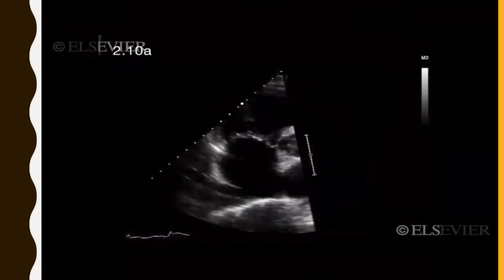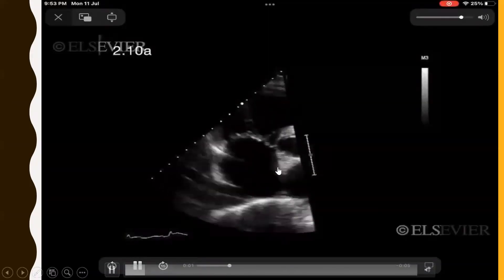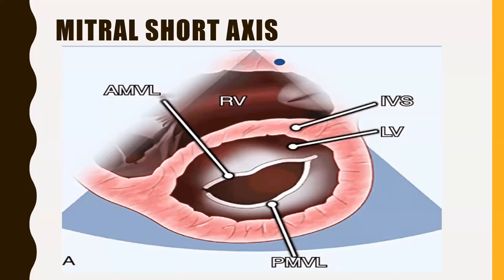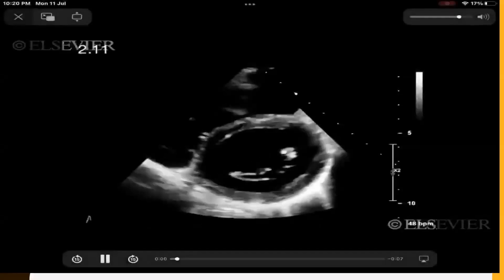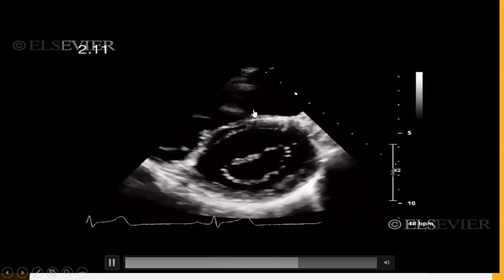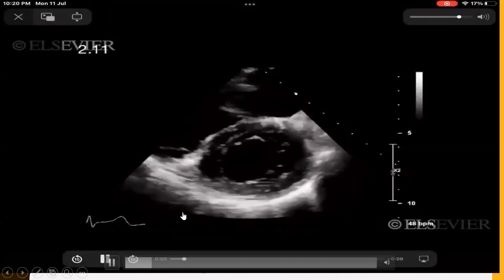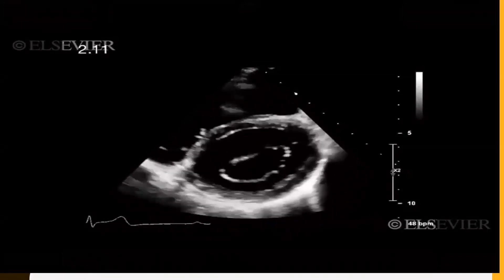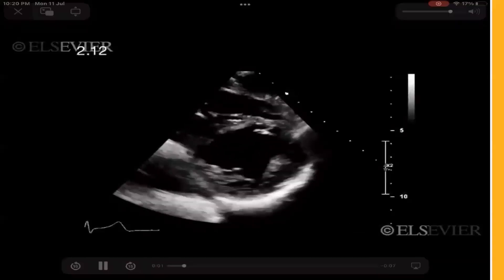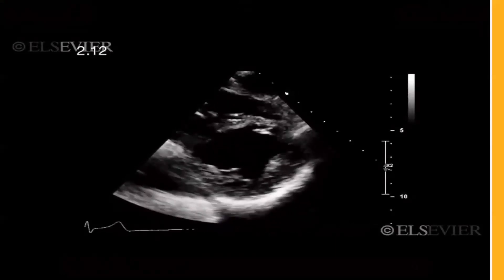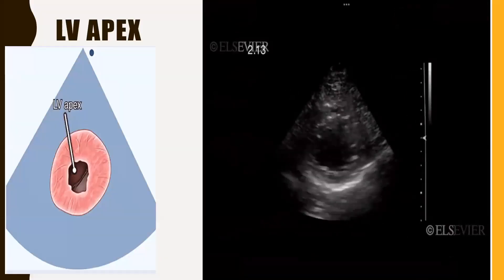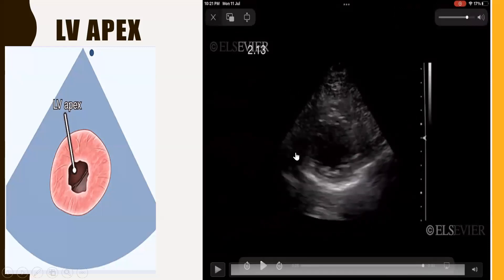The foreshortened PSAX view focuses on the tricuspid valve, with RA visible and the tricuspid valve opening into the RV. Then the PSAX view at the level of the mitral valve shows the mitral valve, interventricular septum, and RV above. The PSAX view at the level of the papillary muscles shows RV and LV contracting along with the papillary muscles. The PSAX view at the LV apex shows the LV apex clearly with no clot.